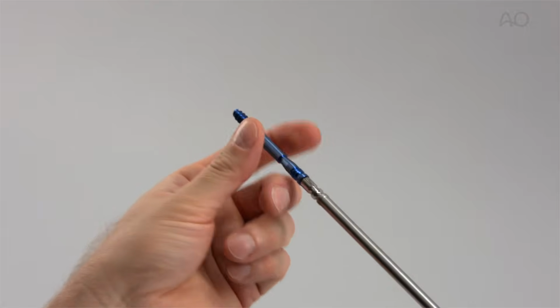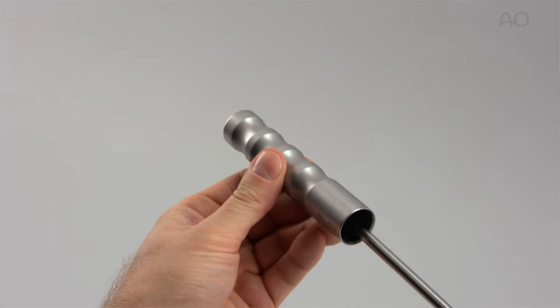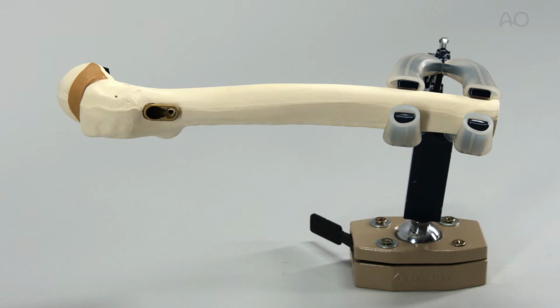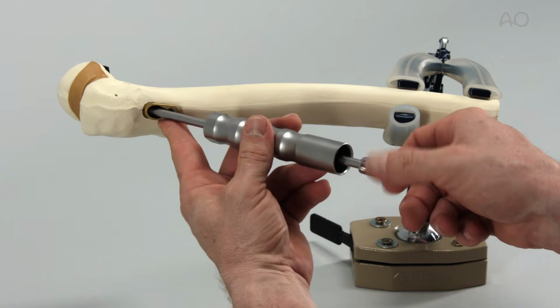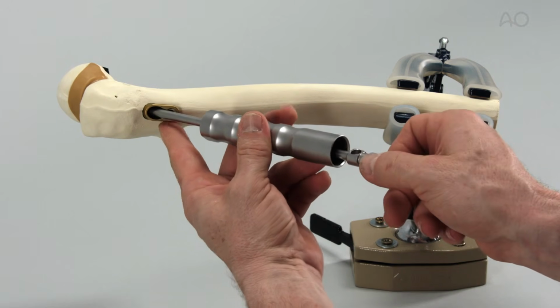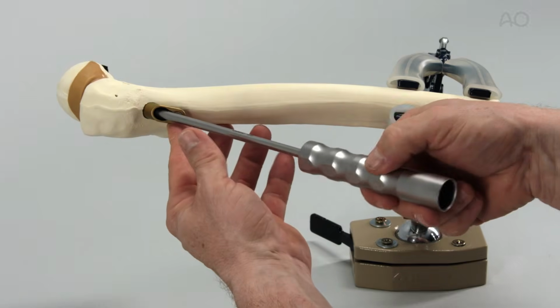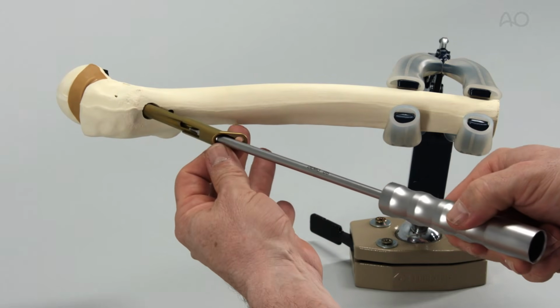The anti-rotation screw is removed from the multifunction rod. The multifunction rod is passed through the cylinder. The assembly is inserted into the proximal end of the plate, and the second, wider, more distal thread of the multifunction rod is turned clockwise to engage the plate bolt construct. The cylinder is manually tapped backwards to remove the bolt and the plate.